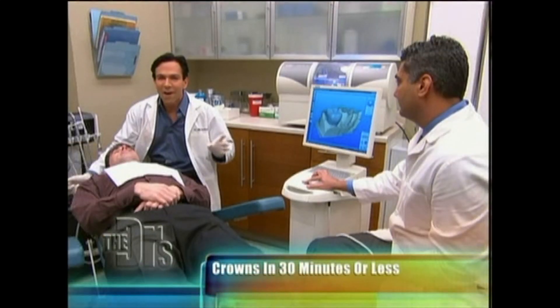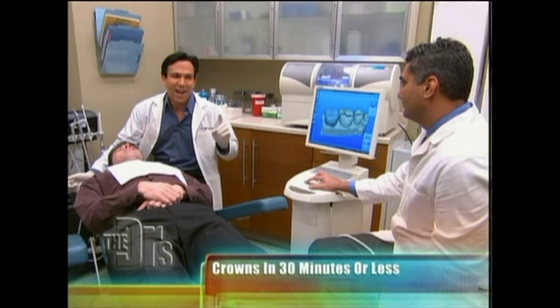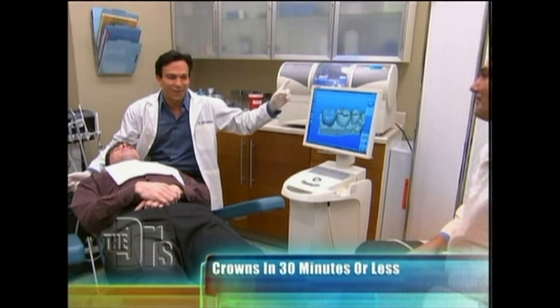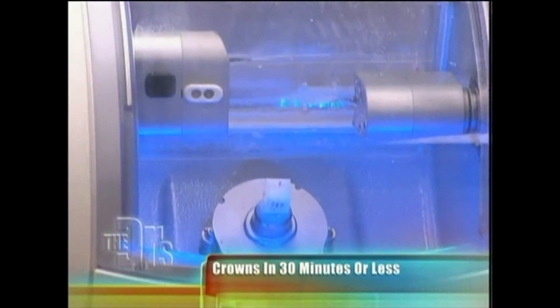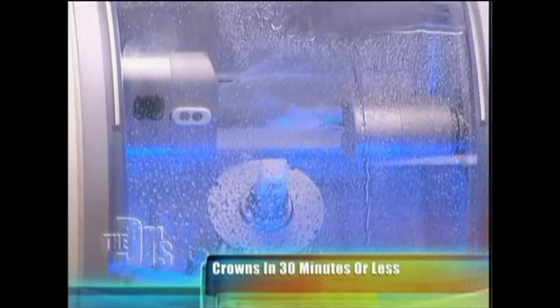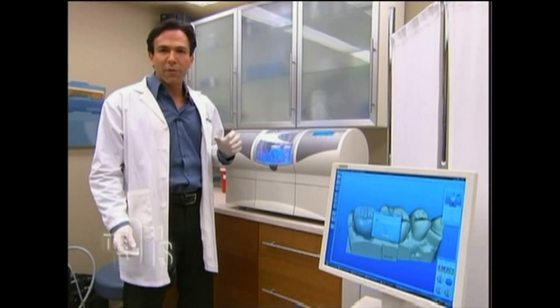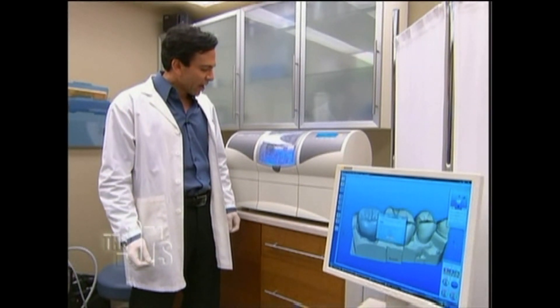So here's the cool part, Travis — all I have to do is push this one button and this machine is going to mill the crown. You ready? Let's do it! Basically, what the CEREC machine is doing now is reading the impression that we took. It's also integrating the patient's bite because it knows where his lower teeth go, so this crown will fit in every dimension. It's almost done here — about three more seconds.